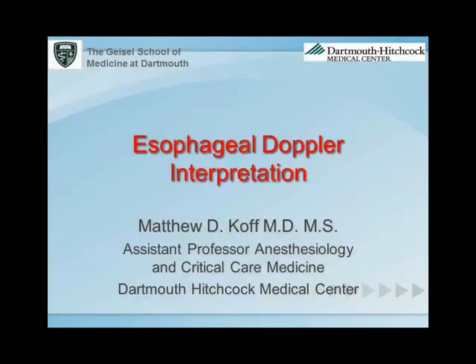My name is Matthew Koff. I'm an assistant professor of anesthesiology and critical care medicine at Dartmouth-Hitchcock Medical Center. This is an educational video about the esophageal Doppler monitor.